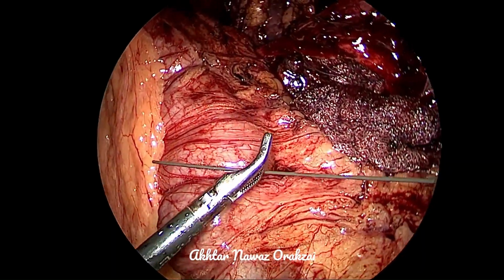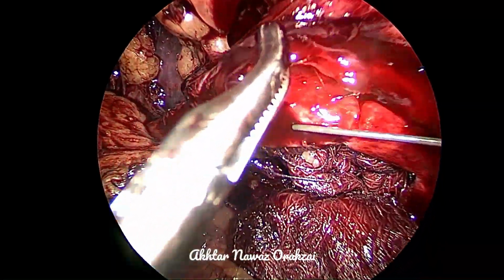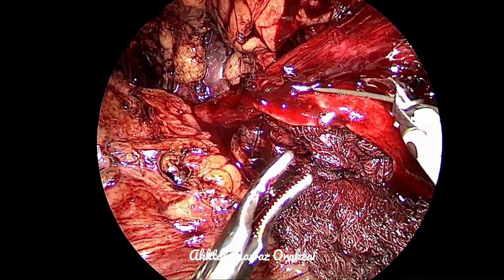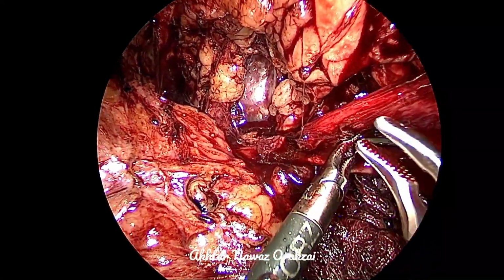port, which is in line with the ureter, for it to be able to hold the ureter in line or in parallel to the ureter.